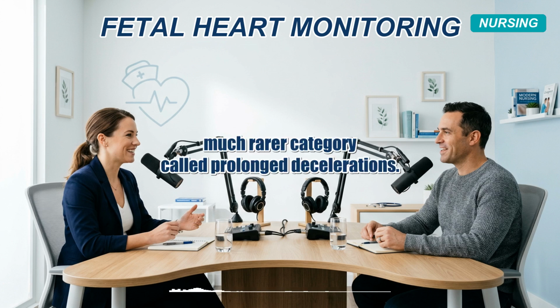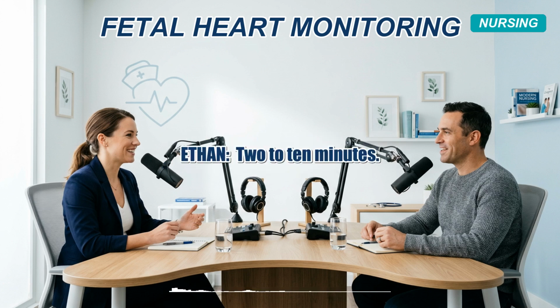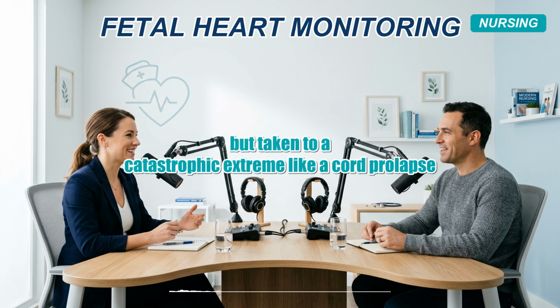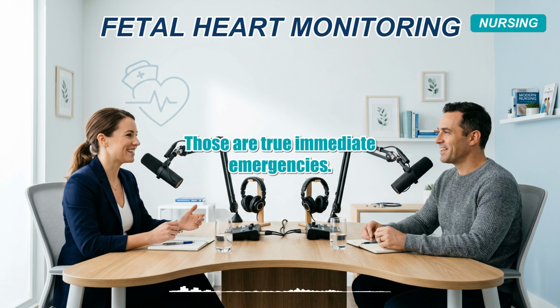And if we zoom out to the extreme end of the spectrum, there's a fourth, much rarer category called prolonged decelerations. Yes. These are sudden drops in the heart rate that last anywhere from 2 to 10 minutes. 2 to 10 minutes, those sound terrifying. They can be. They usually result from any of the mechanisms we just discussed, but taken to a catastrophic extreme, like a cord prolapse, where the cord drops down past the cervix, or a uterine rupture. Those are true, immediate emergencies.